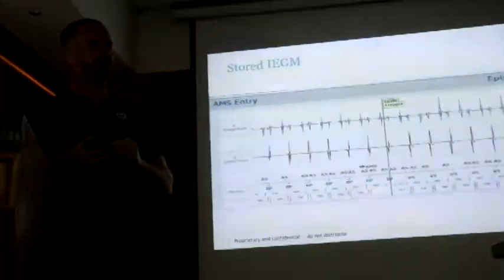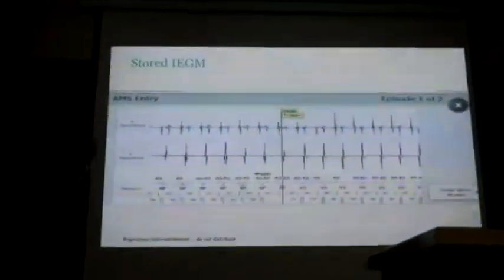Yes, I have a patient like that, but she has not received the pacemaker. Her right and left atrium from the EP study were far apart, so the P wave is bifid. This is the right atrium, this is the left atrium, and there is a big distance, timing wise. Sometimes you see them out at like 140, 150. This is congenital heart, and they're important, right?